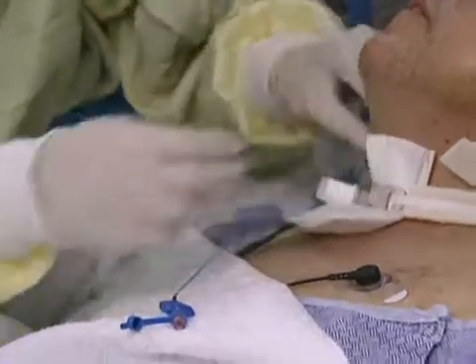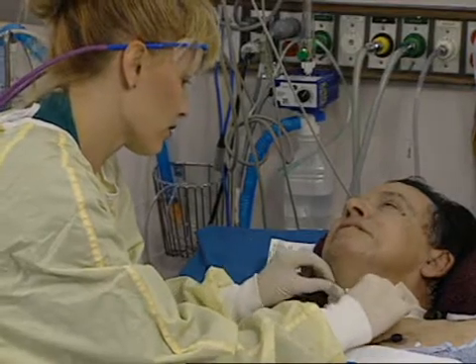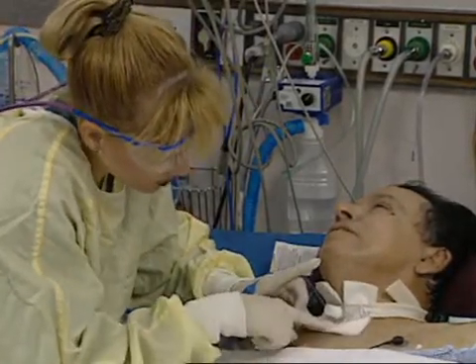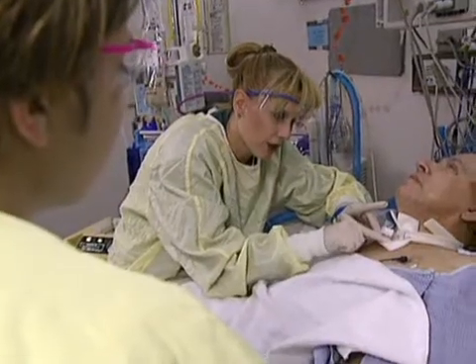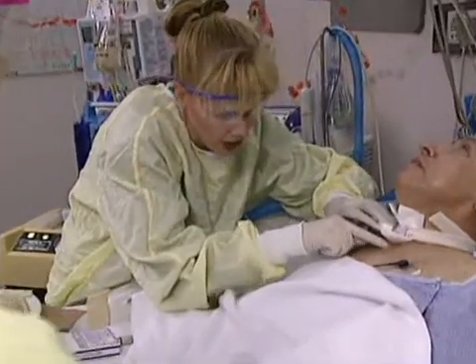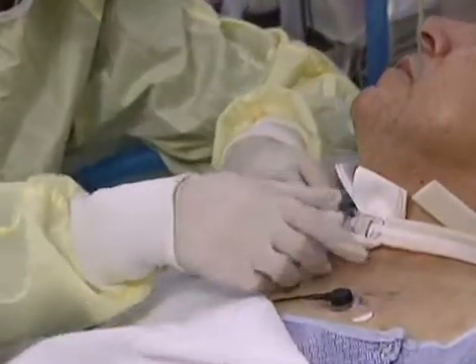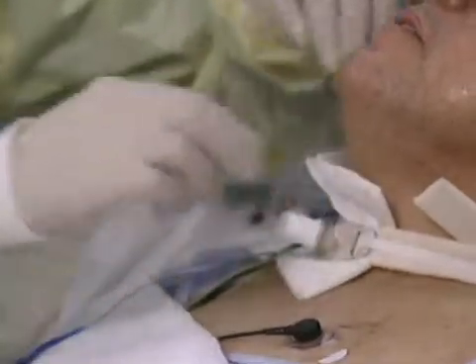Okay, now that I've got that flipped up, and see how now I can snugly tighten it up to where you want it to fit underneath the flange. Because what tends to happen is this flange is kind of hard, and it has a tendency right here to dig in and cause an ulcer. It's very painful. So we want to try to prevent that from happening.